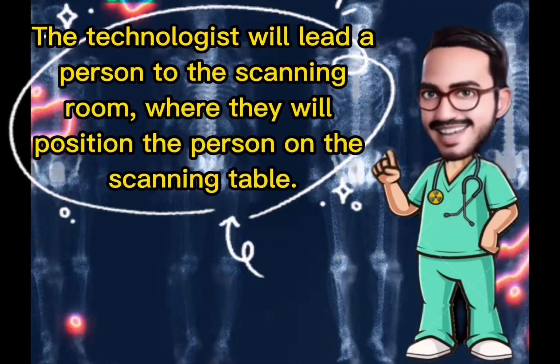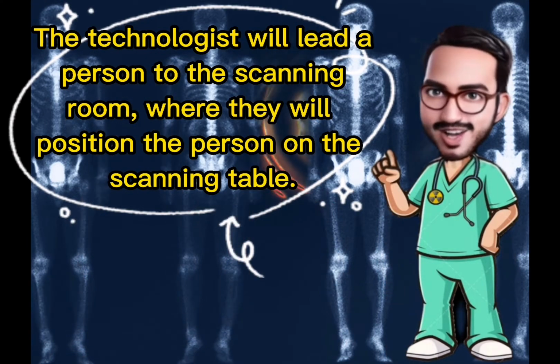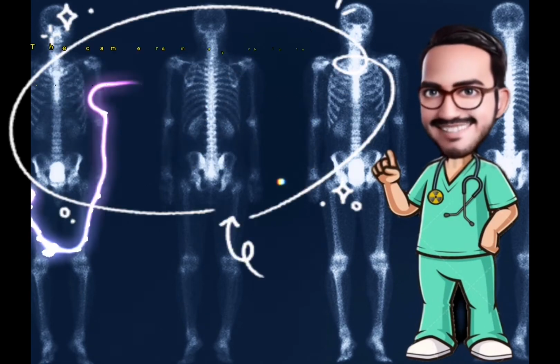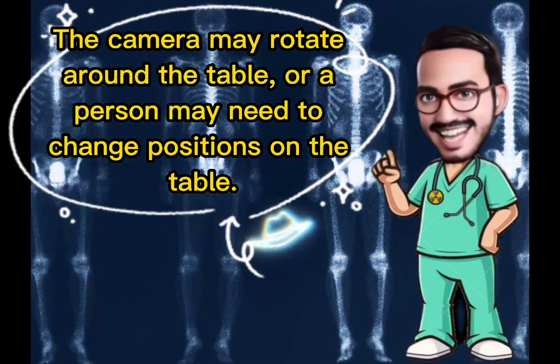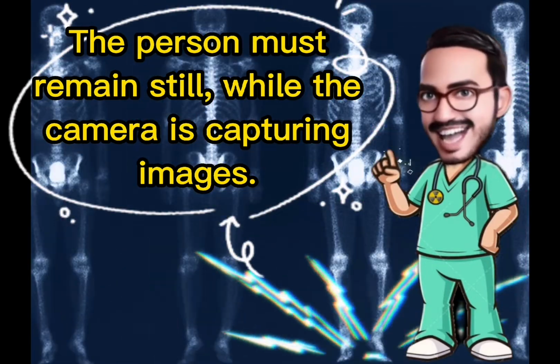The technologist will lead a person to the scanning room, where they will position the person on the scanning table. The gamma camera will take a series of images of the body. The camera may rotate around the table, or a person may need to change positions on the table. The person must remain still while the camera is capturing images.